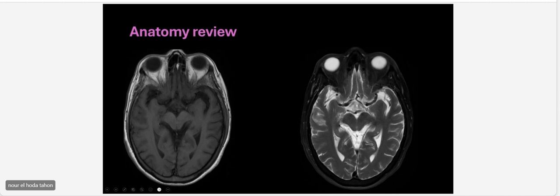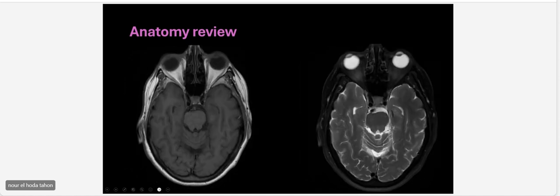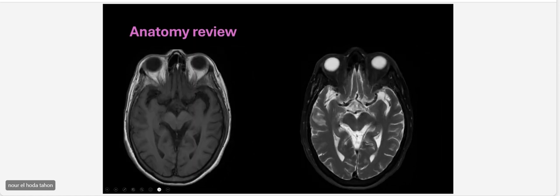And here, this blood vessel is the anterior cerebral artery, so it's like the previous cuts. Okay, so in the previous cuts, this internal carotid artery starts to terminate here, and the next cut gives you the terminus of the carotid artery, and the middle cerebral artery starts to originate here, and the middle cerebral artery on the other side, and the anterior cerebral artery starts to originate here in this area as well.